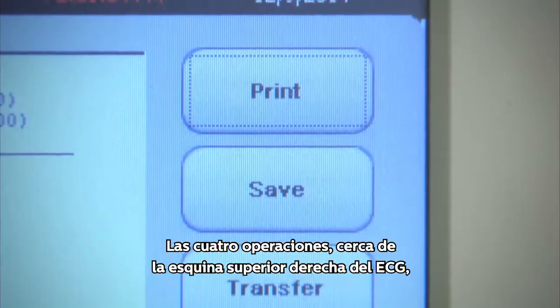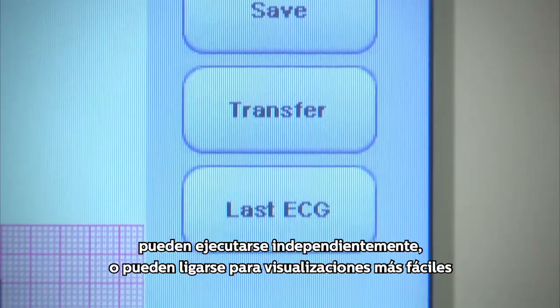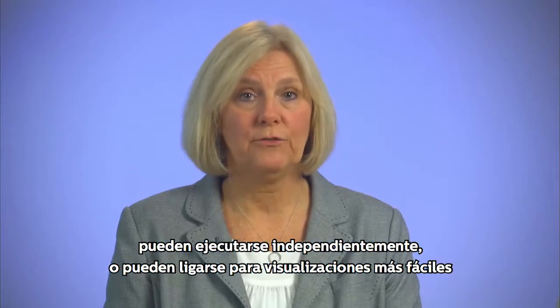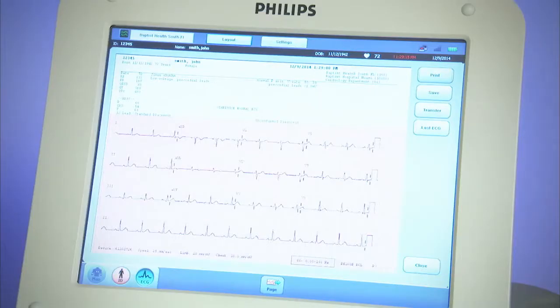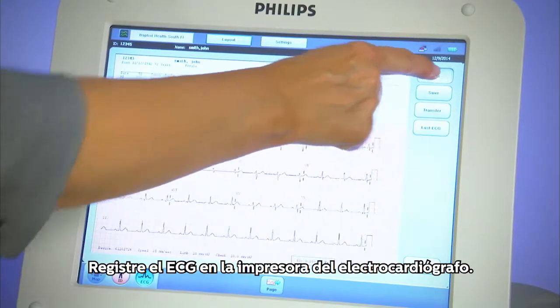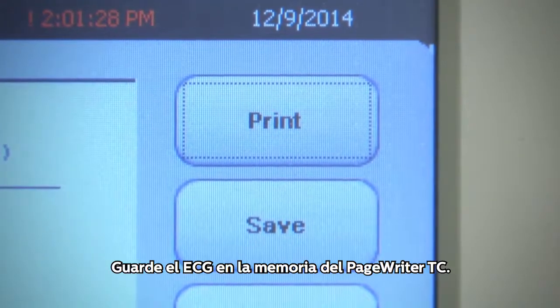The 4 operations near the upper right of the ECG may be performed independently or linked together for ease of use and to ensure that all 4 are performed. Print the ECG on the cardiograph recorder. Save the ECG in the memory of the PageWriter TC.